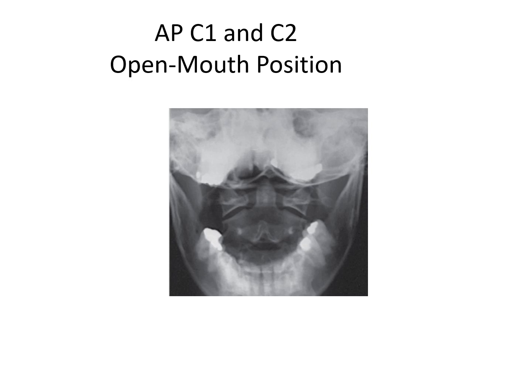Right in the center of the exposure is the dens. The vertebral body of C2 is right below the dens. There are the shoulder pads of the linebacker, the superior articular facets, which articulate with those lateral masses. If you look closely at the dens, you can see the anterior and posterior arches superimposing the dens. It's a bone bridge that connects the lateral masses. One of them is magnified, one of them is not. You can also see the spinous process of C2.